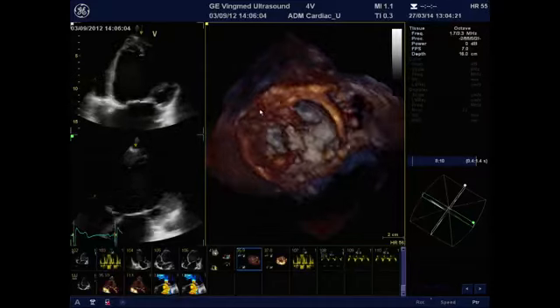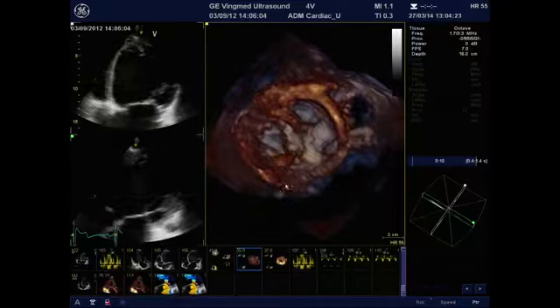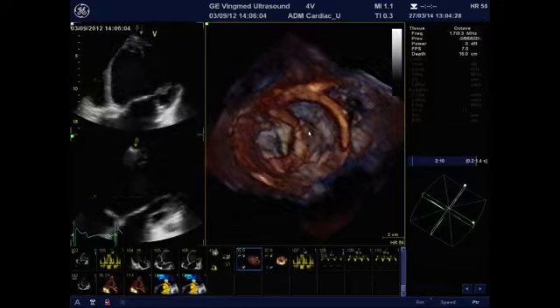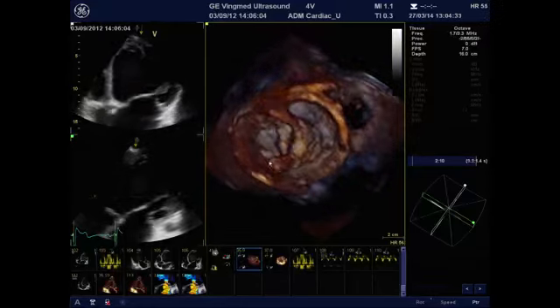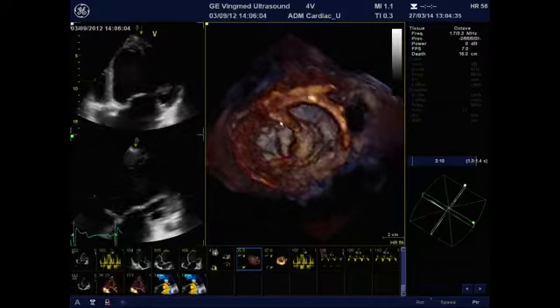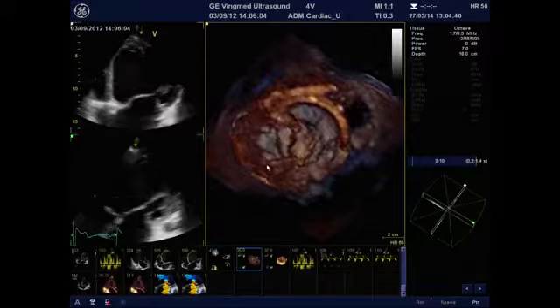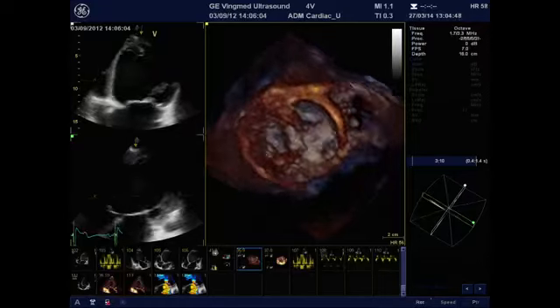You can perfectly underline the geometry of the left ventricle and the connection between the papillary muscle and the mitral leaflet. And if you look here, the axis of both papillary muscles are different because they are attracted apically and laterally due to the remodeling process secondary to the disease, and in these patients, again, it's a dilated cardiomyopathy.